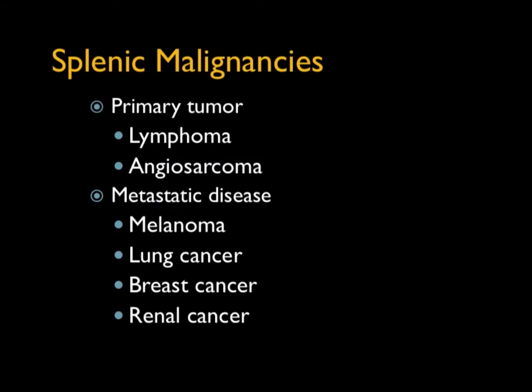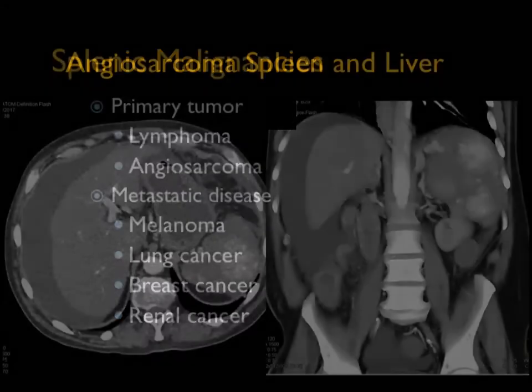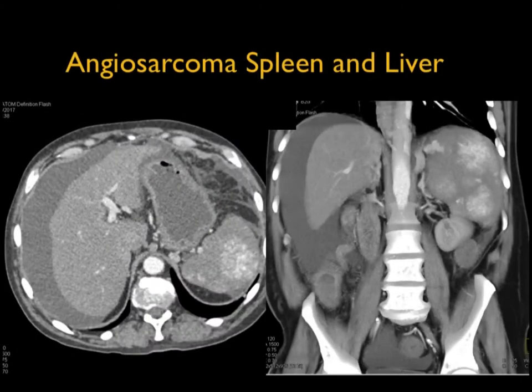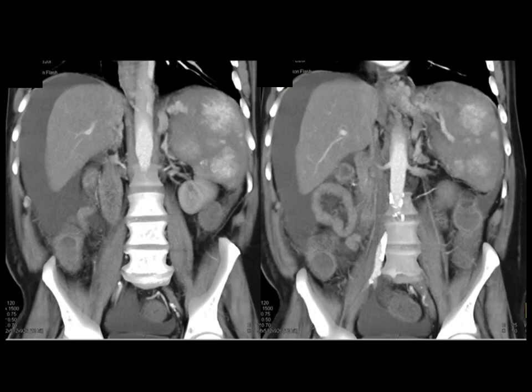Those are the benign lesions. When it comes to malignancy, you're typically going to be talking about metastasis, though there are primary tumors like angiosarcoma and lymphoma. Looking at this case with a vascular lesion of the spleen and ascites — this is more than just a simple hemangioma. These lesions are irregular, very bright, and there's an enlarged spleen. This is a very good appearance for an angiosarcoma of the spleen.